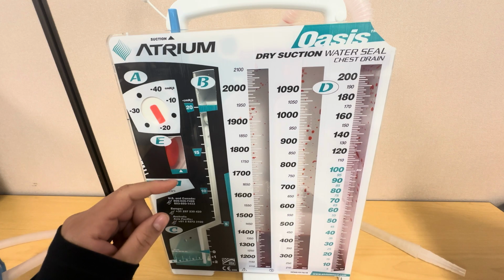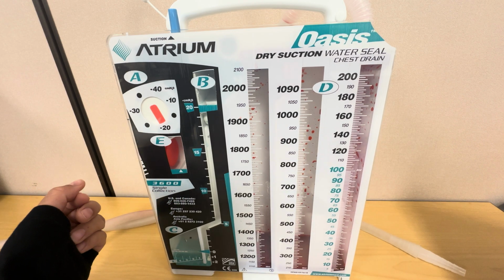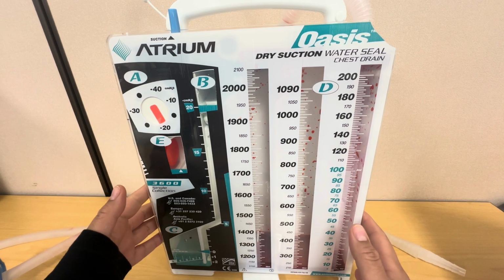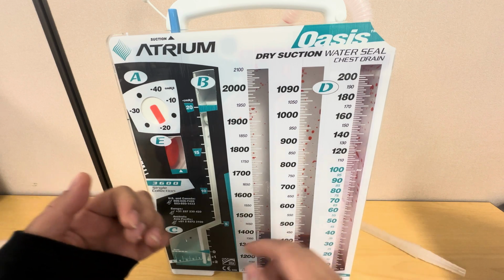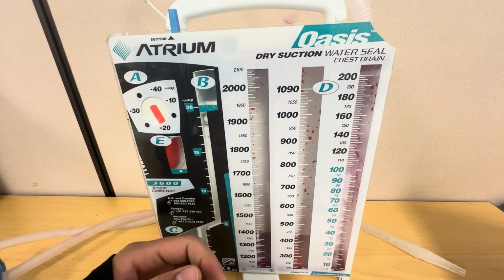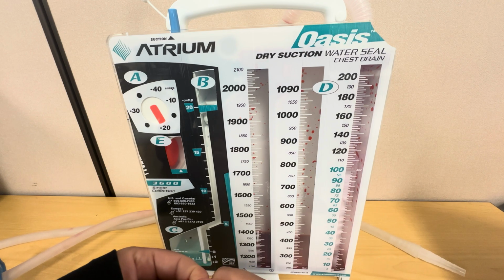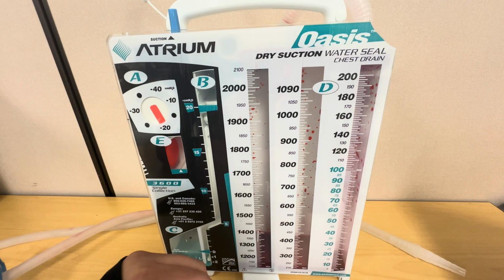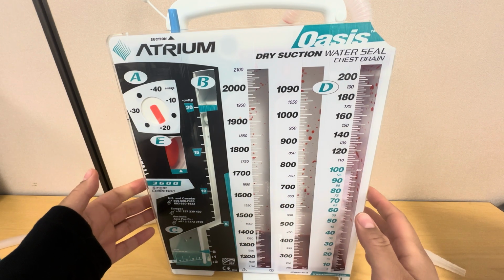So as a nurse, what we want to do aside from the chest tube is monitor our patient's respiratory status, their vital signs, their oxygen saturation, just everything. And we want to also know what to do when things go wrong. So it's very important to monitor all of these chambers. They all play a very important part in the patient's care.